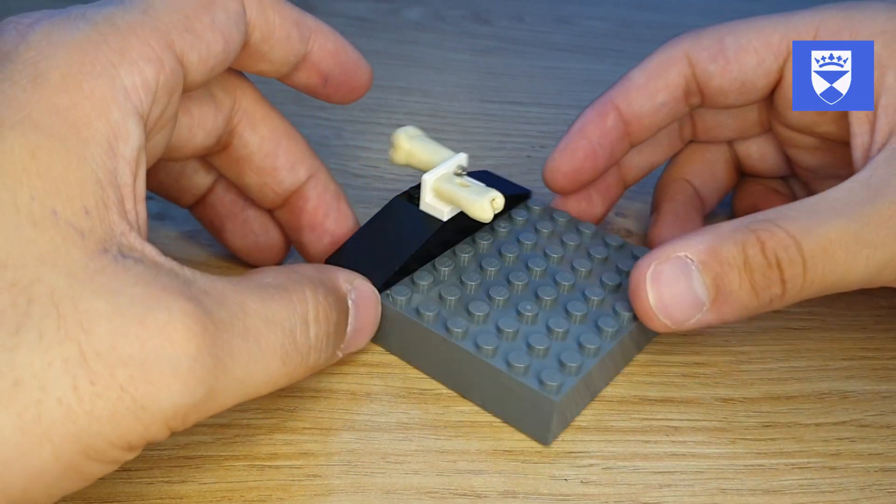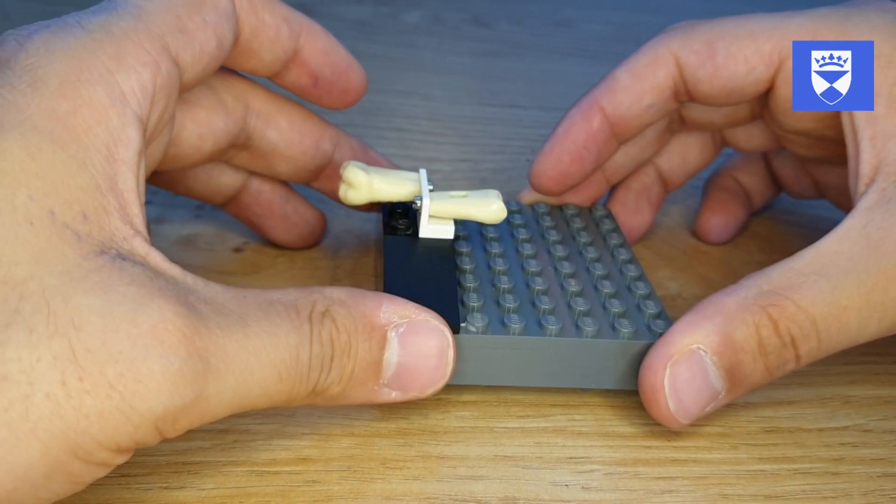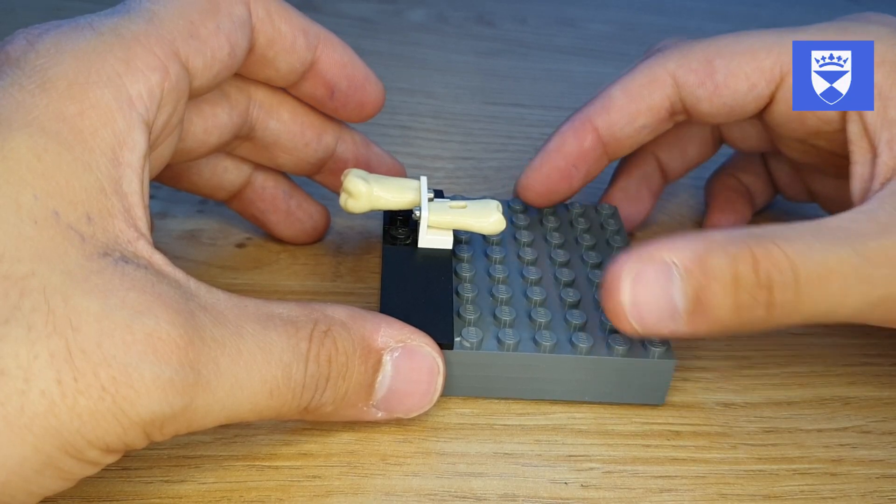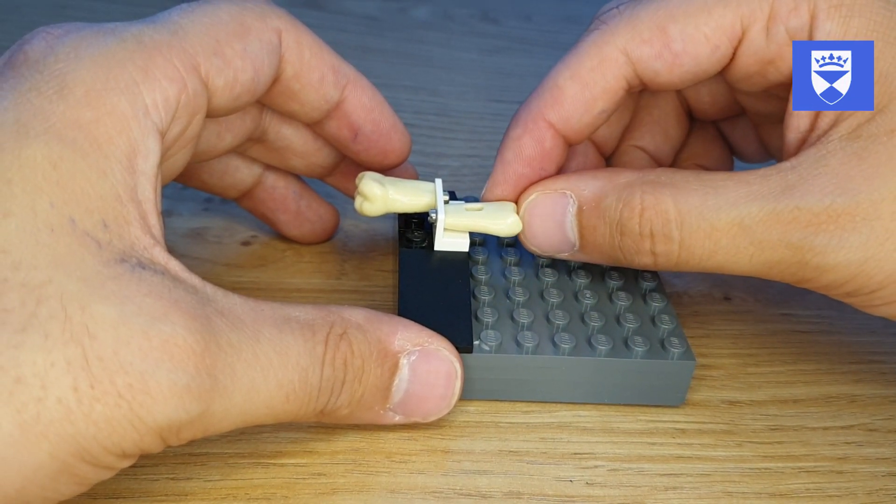The overall construction of this costs about £1.50 to £2 to make and allows us to reuse all the old teeth that we've used in other courses.